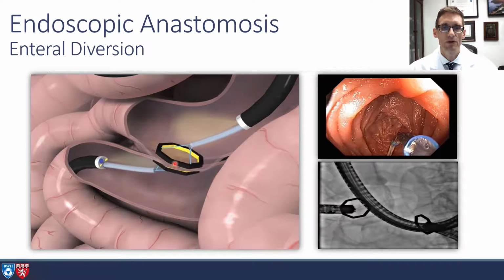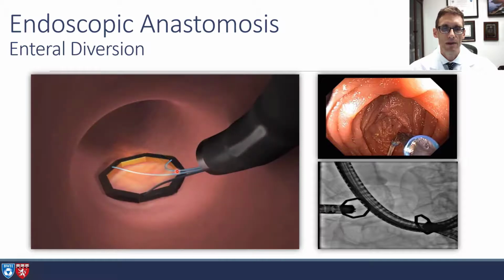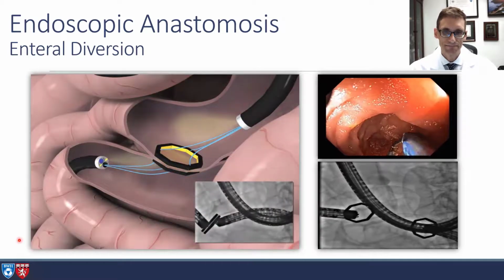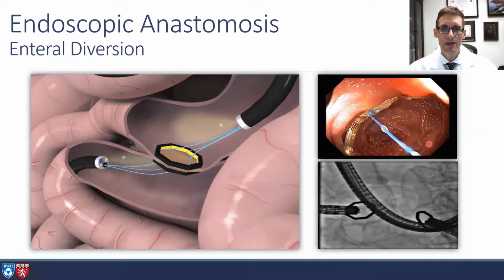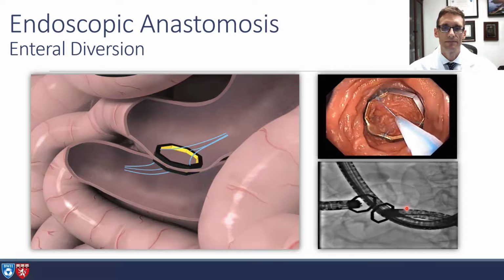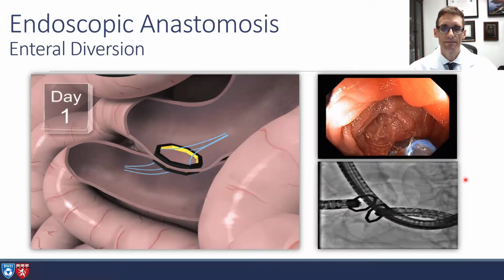And then you have tissue necrosis that occurs here in tissue remodeling around the magnets. The magnets will then pass in the fecal stream, and you'll have a side-to-side anastomosis. So it looks like coming out of the channel, and then you need fluoroscopic guidance, of course, for this. And mating the magnets there.